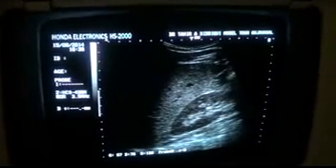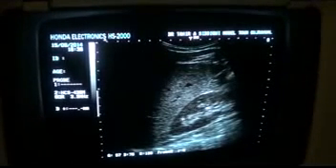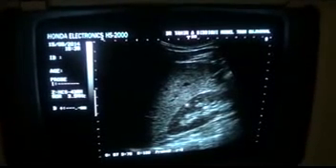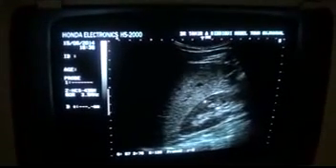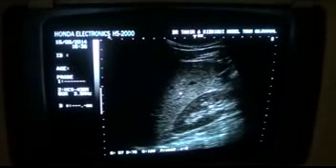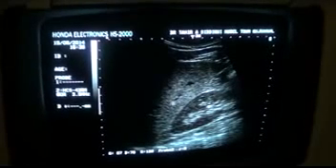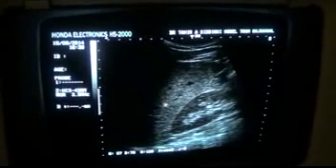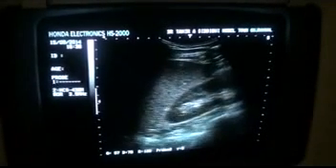Now what about the echogenicity of the parenchyma? Parenchyma means including the cortex as well as the medullary pyramids. Now you see that the echogenicity of the kidney is appearing less as compared to the adjacent normal liver. So this is a normal liver, and the echogenicity of the renal cortex is appearing less. And the definition for a normal renal parenchyma is that, provided the liver parenchyma is normal, its echogenicity will be equal to or less than the adjacent parenchyma, which is the case in this normal patient with normal liver and normal kidneys.